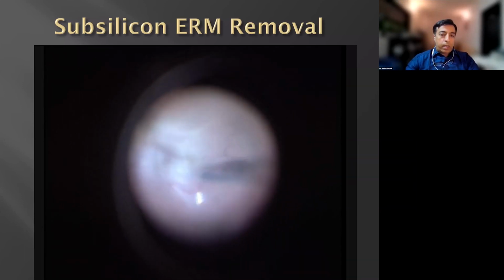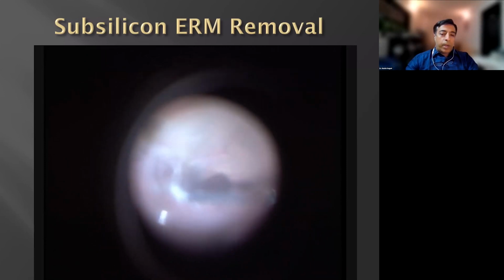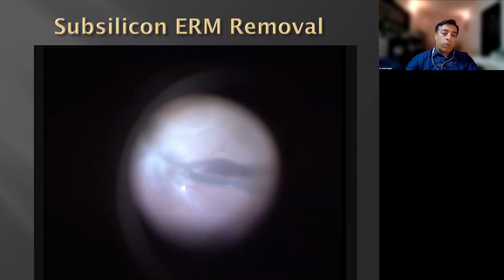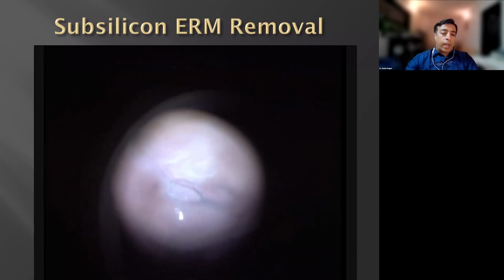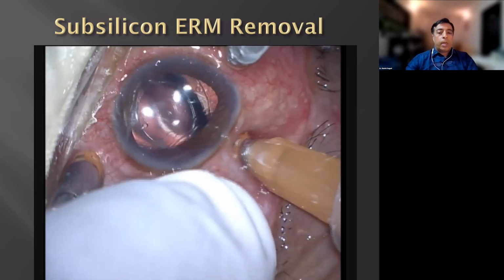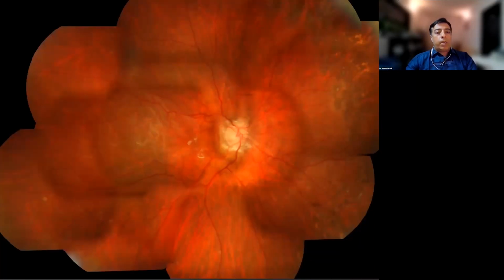So here you can see that under oil, without disturbing it, what we do is we put an infusion cannula but leave it on air, so that no fluid comes in to create emulsification of oil or increase the emulsification. You just keep it on air, so that if at any point the pressure goes down, the air can compensate, and at the end you can top up with more oil, which can be retained.